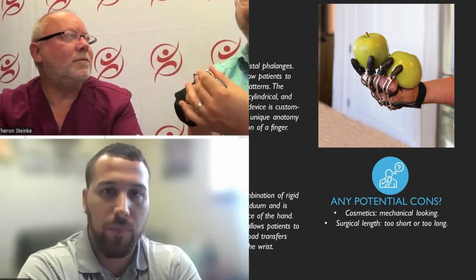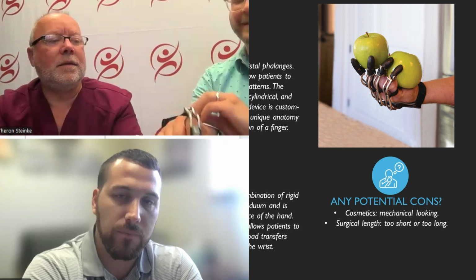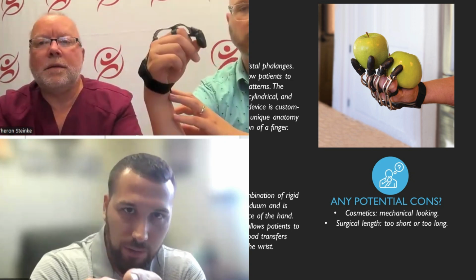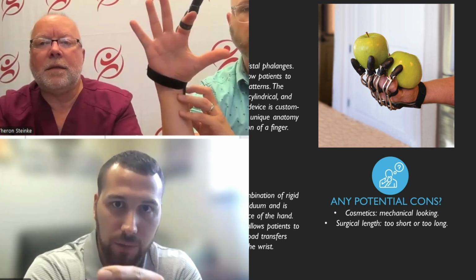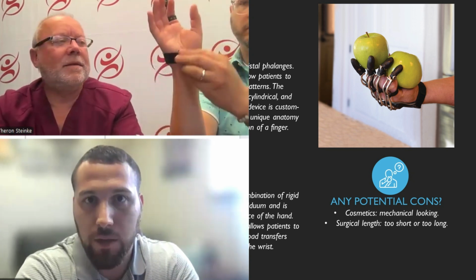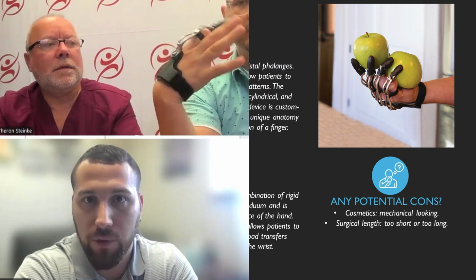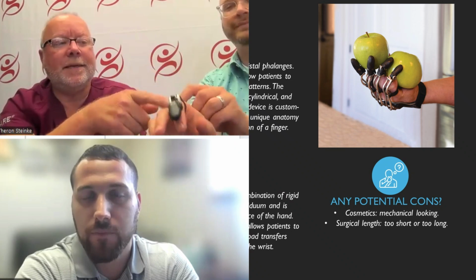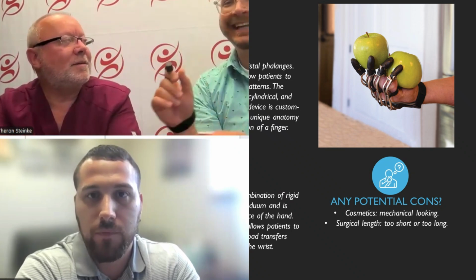It's very hard to do with your finger. I'm trying to bend my finger down so that, there we go. One thing you see Theron doing as well is that the suspension of this device isn't only the ring on the finger. There's a strap that typically goes around the wrist as well. That helps position the MCP driver in line with that digit. It would be back further on his hand, but because he can't get the ring back far enough, his finger's in the way.